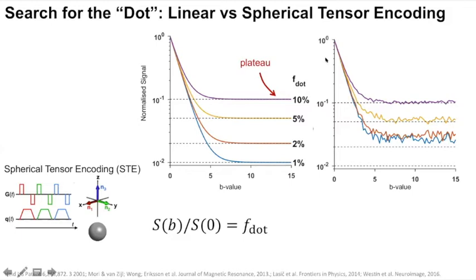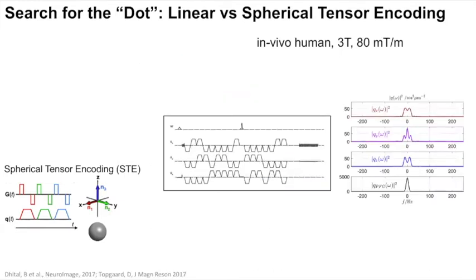So if we take the magnitude image, you have Rician or non-central chi noise, which means that even if your signal is truly 0, it will be moved upwards artificially because of this noise floor. So that means if you have a high standard deviation, this upper limit of the dot fraction that you can actually measure becomes higher.